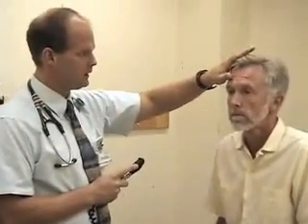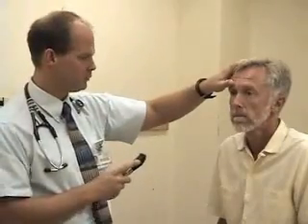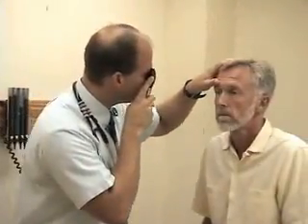Okay. If you can find something that's at about your eye level, perhaps something right about there, I'm going to have a light that's going to be kind of bright in your eyes. Best you can just stare right past me. Okay. Now, I'm going to use my left hand here both for my own proprioception and to steady the patient's head. Also, that way, if I bump into something, I'm going to bump into my thumb and not his eyebrow. And I'll get back here and check for his red reflex, and then gradually come in. And if I'm about 15 degrees from the midline, I should come in right on his optic disc.